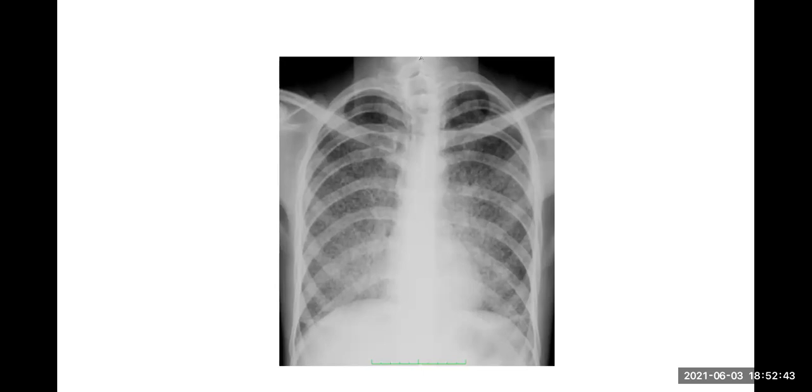Here you can see in this section multiple fine nodules everywhere. Fine nodules. So these are called miliary nodules. Miliary nodules, or miliary mottling.